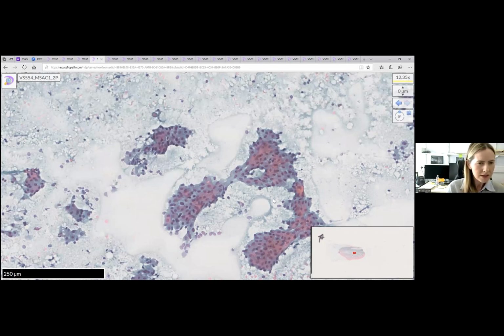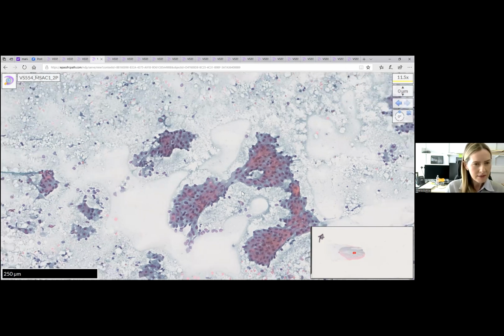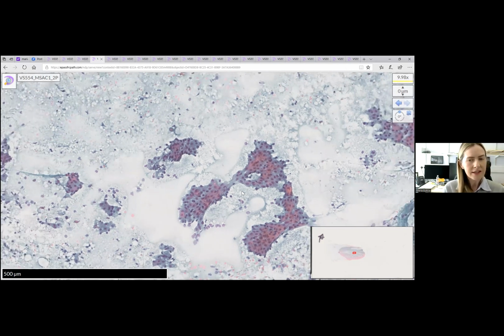So things to consider here is that sometimes Warthin's tumours can have squamous metaplasia, but these are often non-keratinizing. The second thing to consider is that these can be PET avid, so they're often found incidentally for workup of other lesions in patients. In terms of the exam, calling it a Warthin's tumour and using the Milan classification of neoplastic benign would be the correct thing to do.